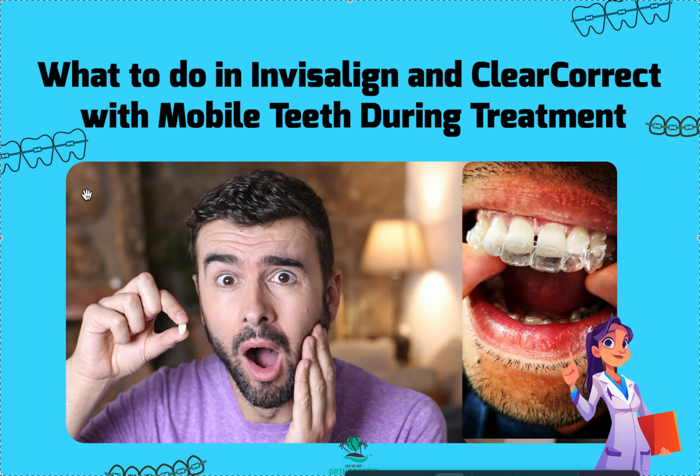So take a look at the treatment plan, and you guys aren't going to know. You can look at the TMTs and figure it out, but you're probably not going to know. It really takes a trained orthodontist's eye to tell you if this is an aggressive treatment plan or not. So the first thing I'm going to do is slow the treatment plan way down. Now, if you're paying for an express case or a light case or a go case or a moderate case, this may not work. So you probably picked the wrong plan.